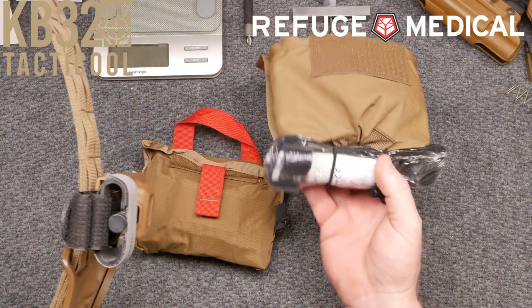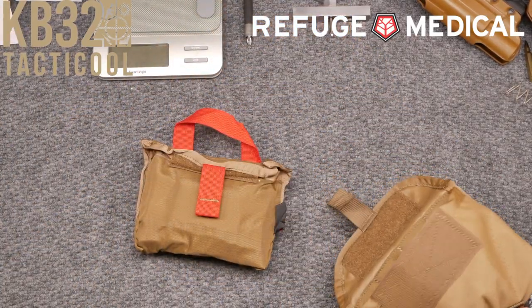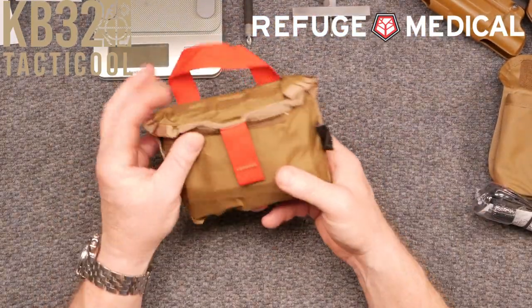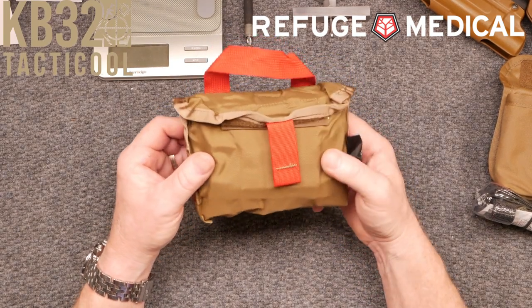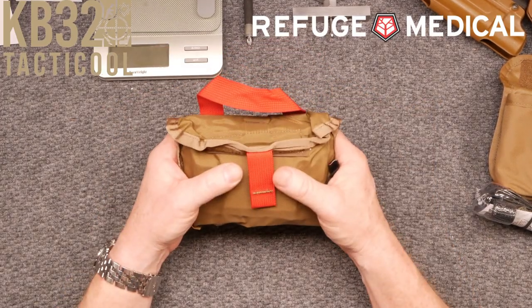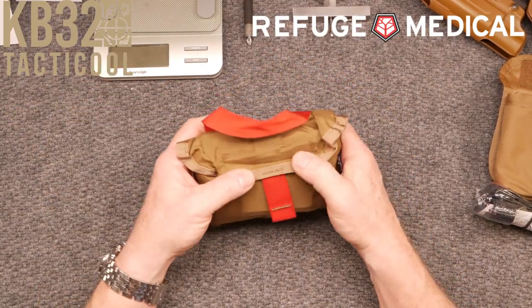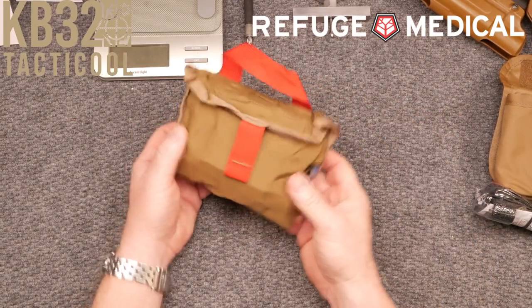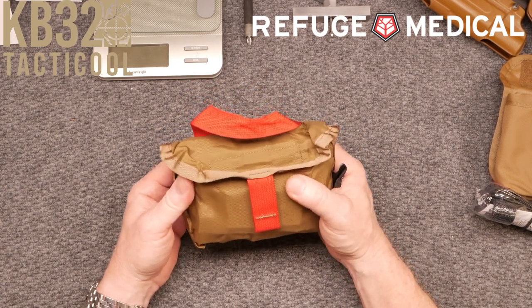On my belt I'm running a Gen 7 with the same setup. First thing you want to do is get these things out, unwrap them, and make sure they're ready to deploy. Slimmer and lighter than the other MOLLE compatible kits, the SOB is at home on a war belt, plate carrier, chest rig, headrest, or glove compartment. The kit has been developed with input from shooting sports professionals, U.S. Army Special Forces, and U.S. Navy Special Operations personnel. It's available in four colors: Black, Coyote Tan, Ranger Green, and Multicam.